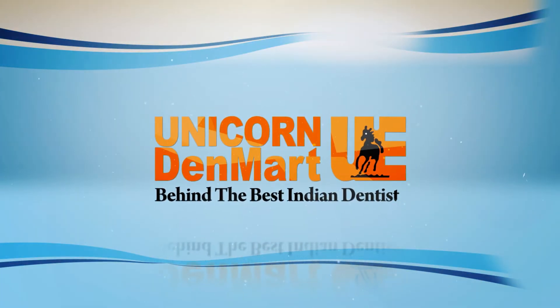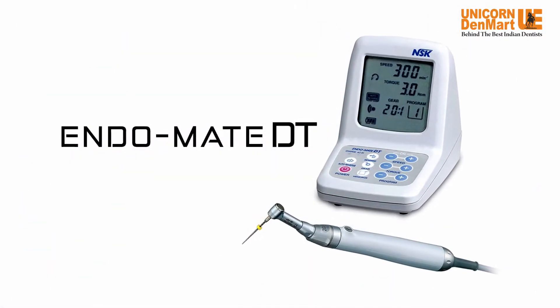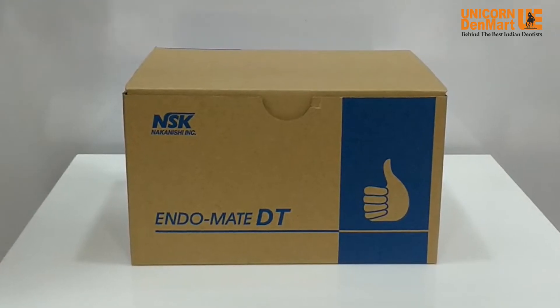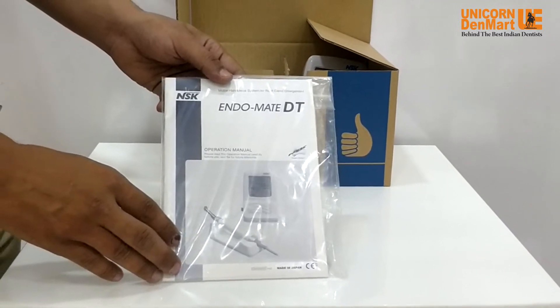NSK Japan in association with Unicorn Denmark is proud to introduce the smart and portable endo motor, Endomate DT. Let's begin unboxing the Endomate DT from NSK Japan. This is the operational manual that will help guide you through installation and operation of the endo motor.